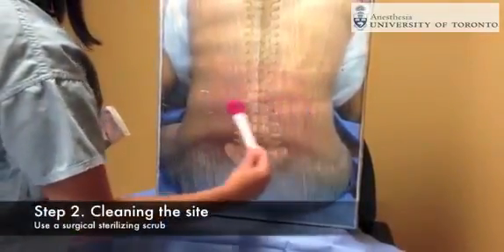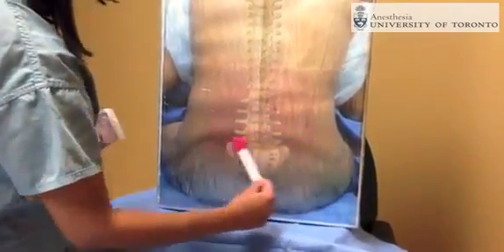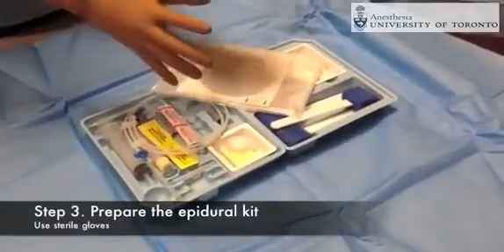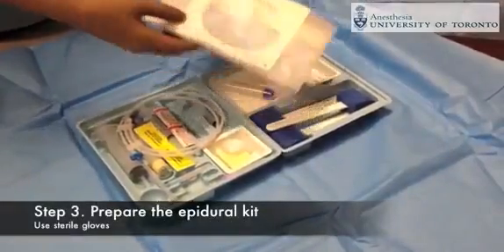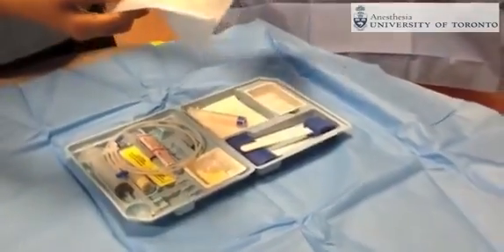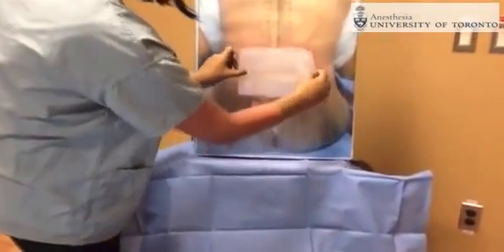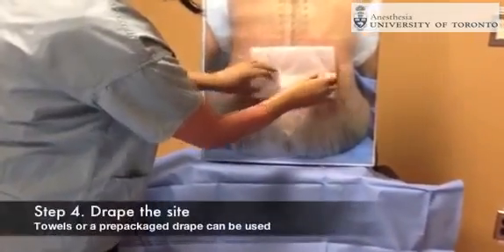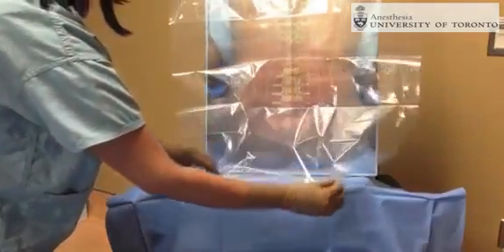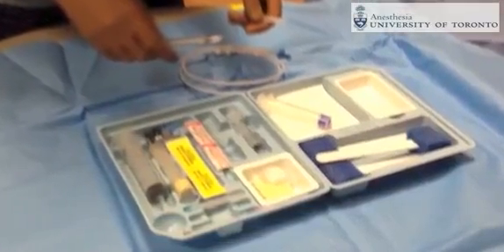To ensure sterility of the area where the epidural is going to be placed and to ensure aseptic technique, the operator performs a sterile wash of their hands and wears sterile gloves before proceeding to place a sterile drape on the patient's back. Then the epidural kit is set up for the epidural procedure.